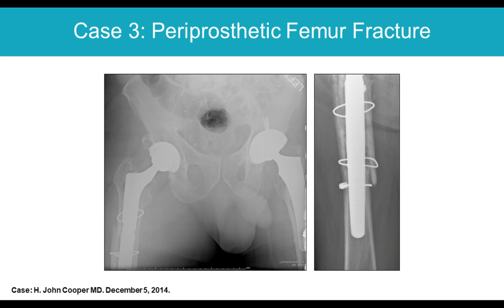So when we ended surgery, I normally would have put an Aquacell over his incision, but in him, because we had it, we used that negative pressure dressing. And we were fortunate to do so because the lack of fascial closure caused him to have a lot of drainage from his incision through the dressing and into the canister.